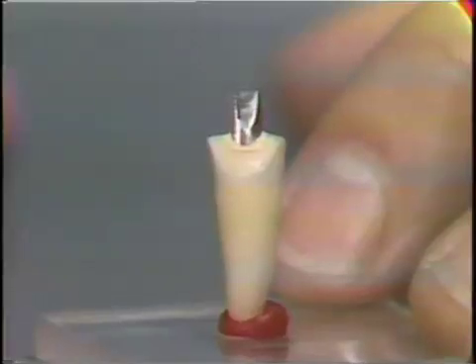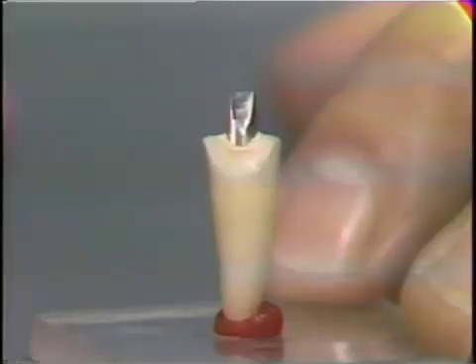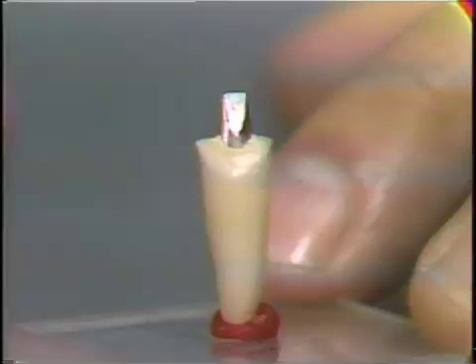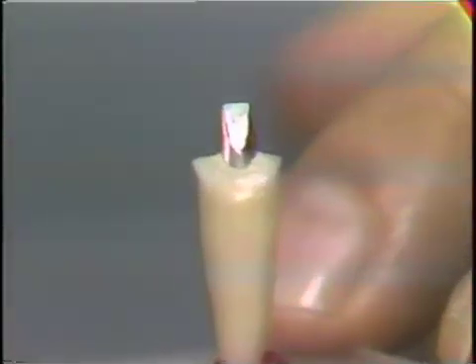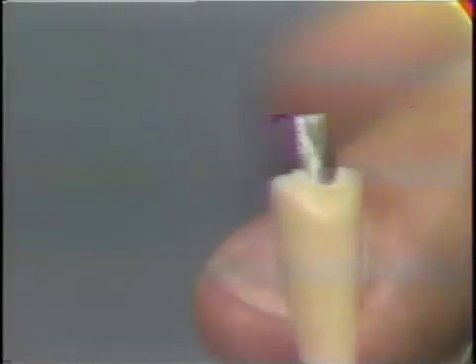Notice here that, of course, the shoulder is somewhat wider, and this is possible because we're not concerned here with the vital pulp. And by having the shoulder a little wider, we have that much more room in which to develop the gold form and whatever aesthetic facing is going to go over it. So this then is a little smaller in general contour than the same preparation done on a vital tooth.